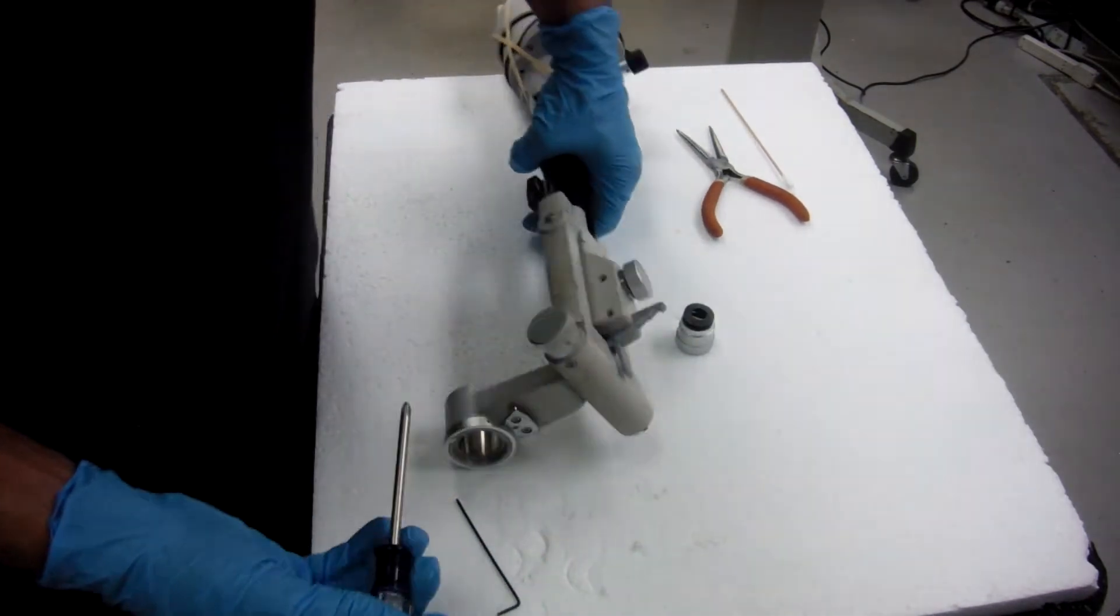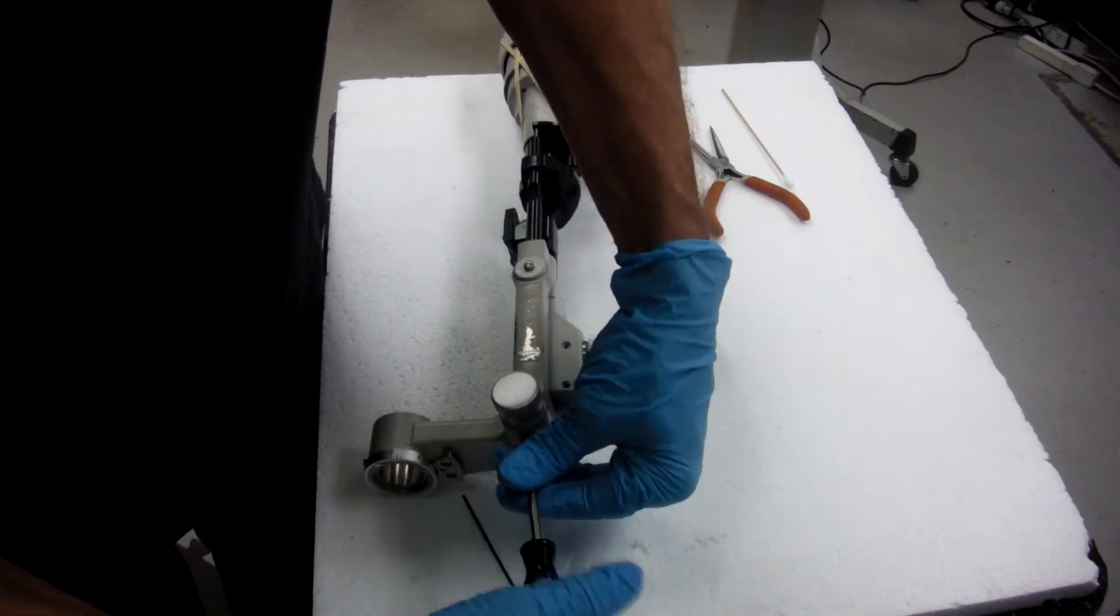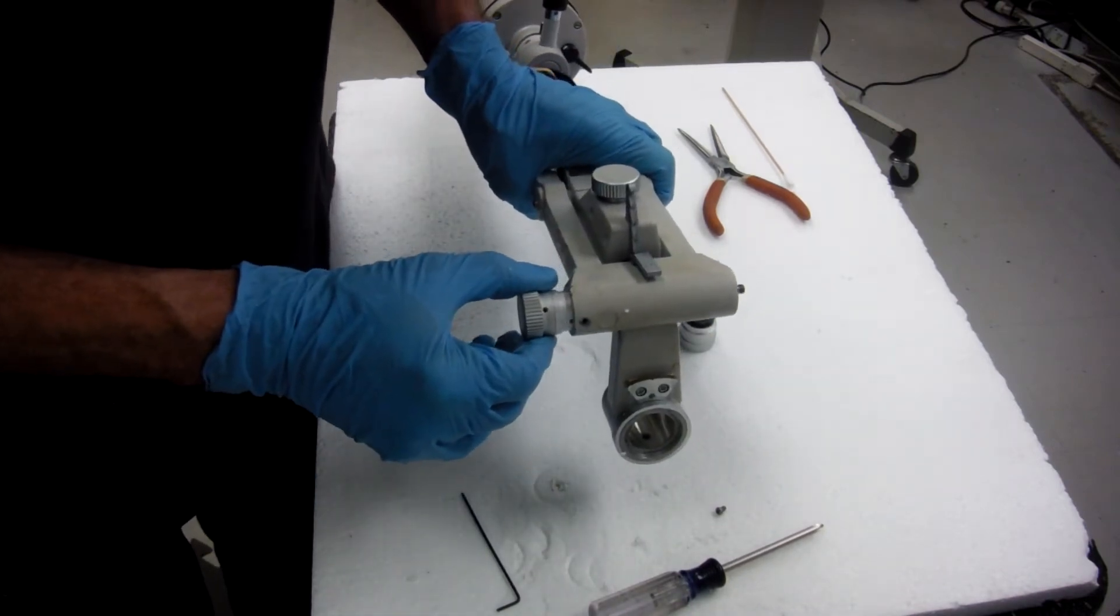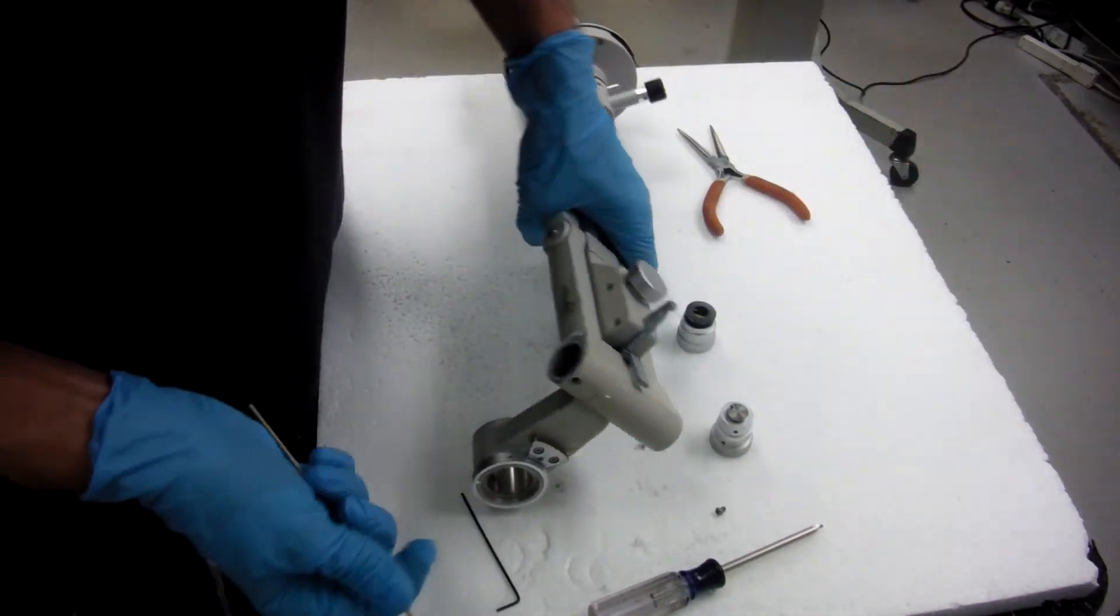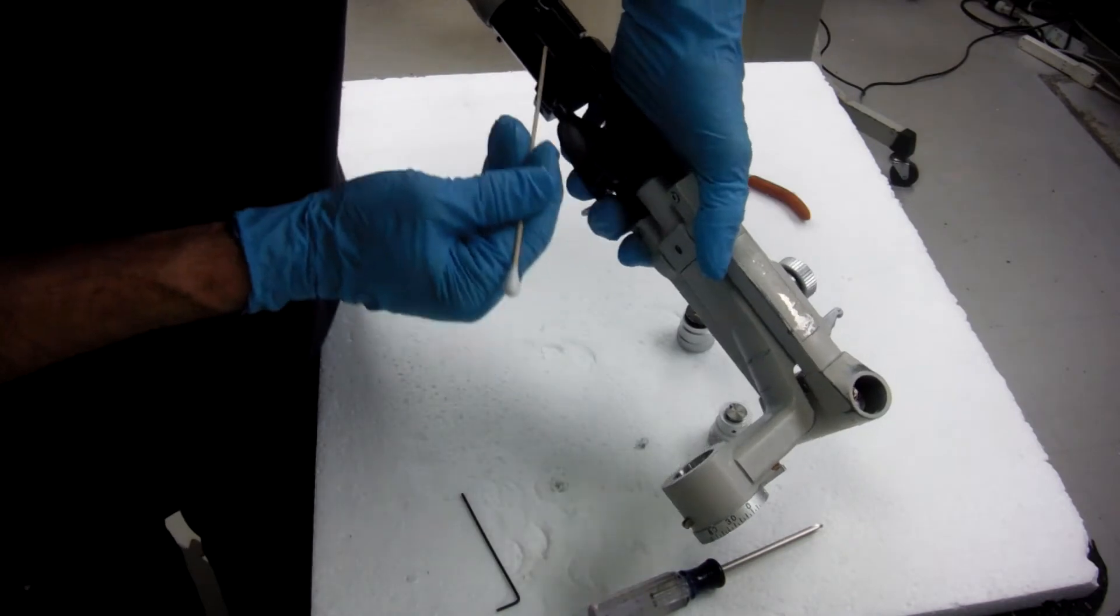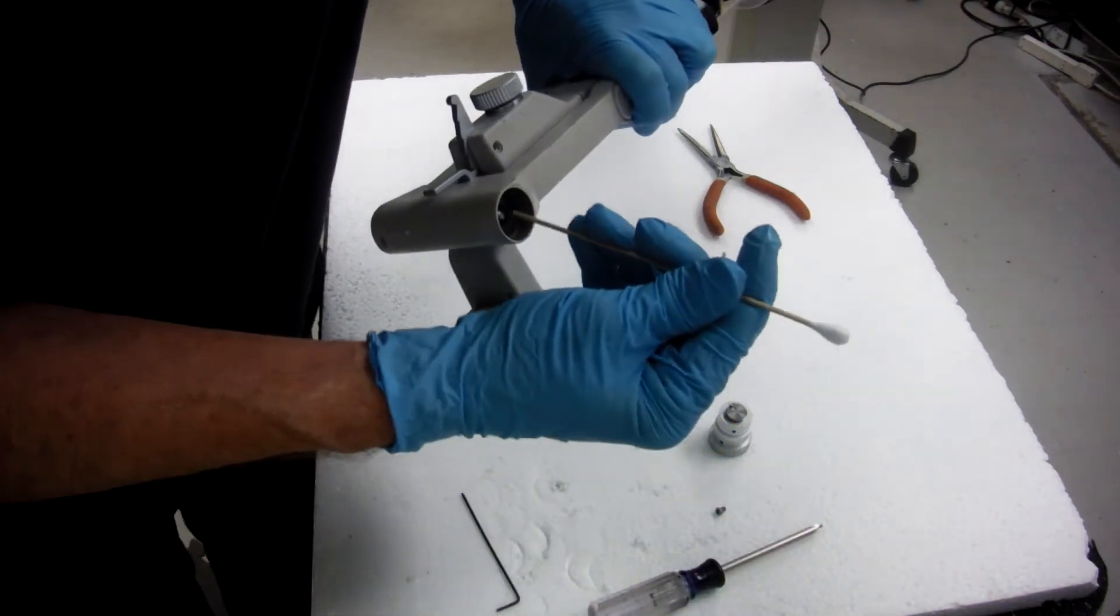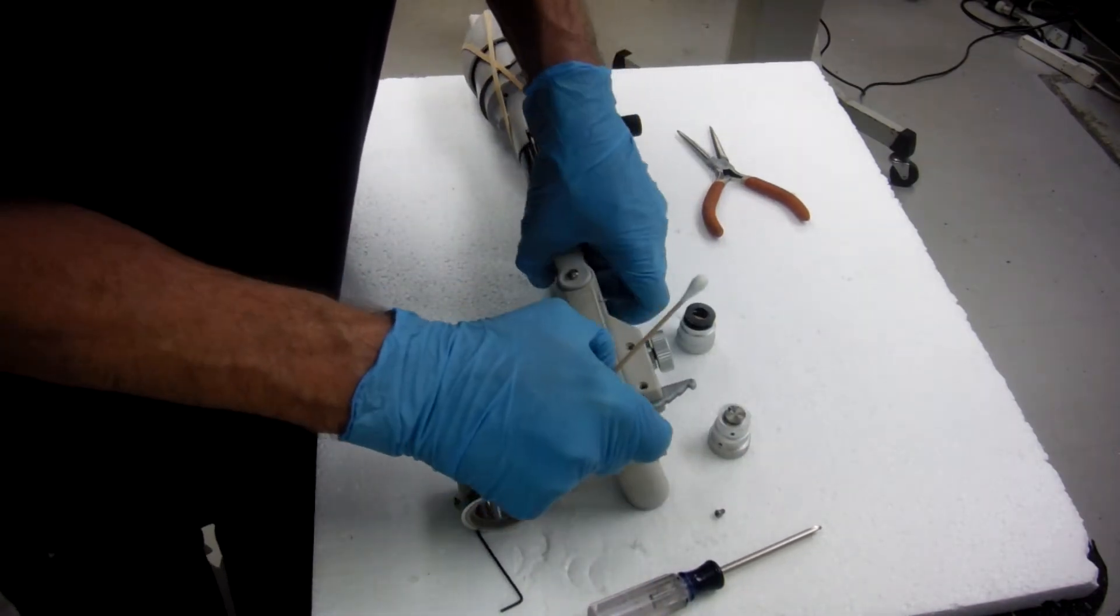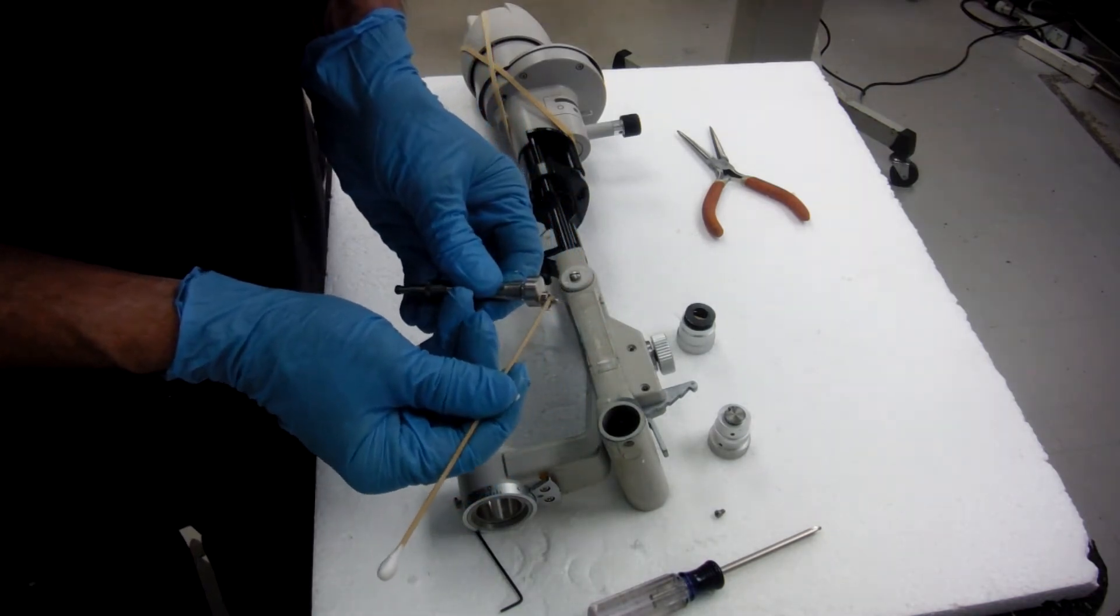Now we're going to take this screw out. I'm going to pull this out. This is the inside. This is pushing the rod up, which is pushing the table. I'm just going to push this through. You don't want to lose your bearing and you have little spacers on each side. Don't lose those.